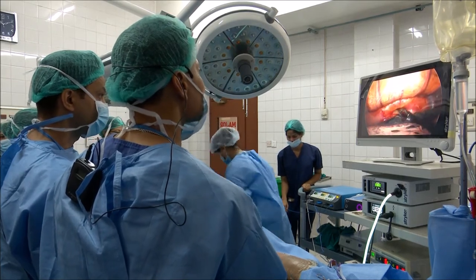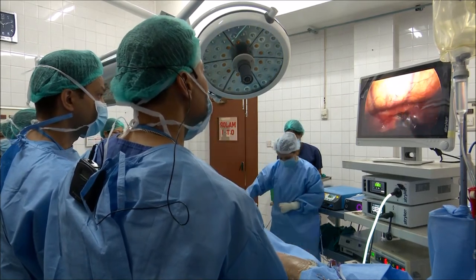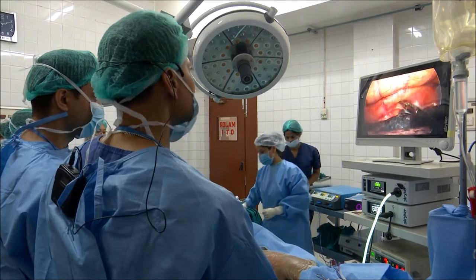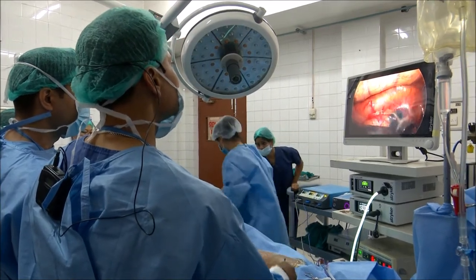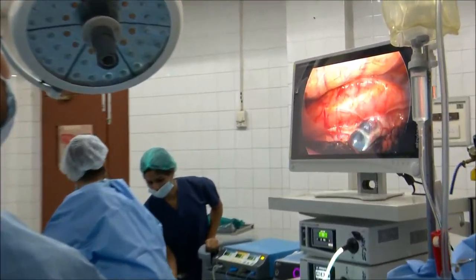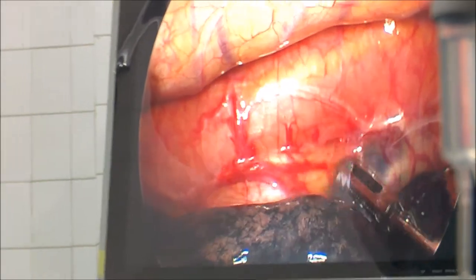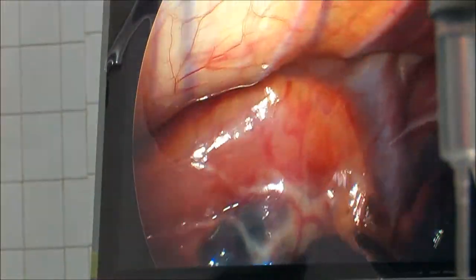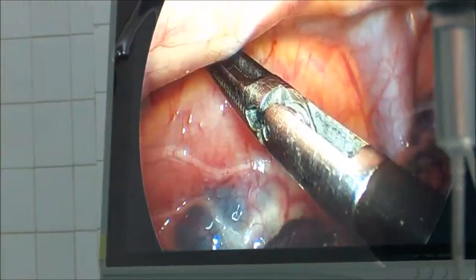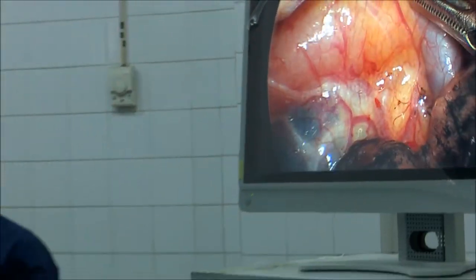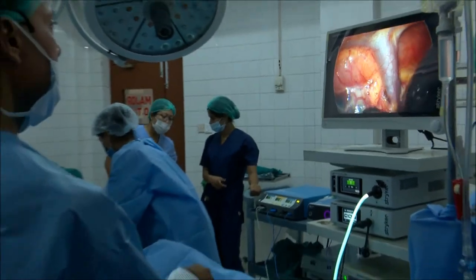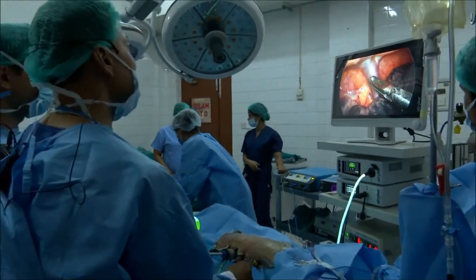This is the esophagus — this one. Can you see? This is the esophagus. These are the lymph nodes you can see. This is the white structure — this is the vagus nerve. If you move upward, this is the azygos vein. You can see this is the azygos vein, and this is the azygos arch.